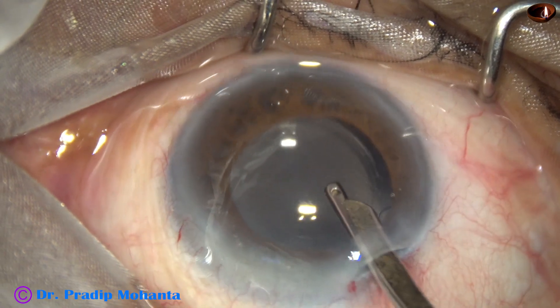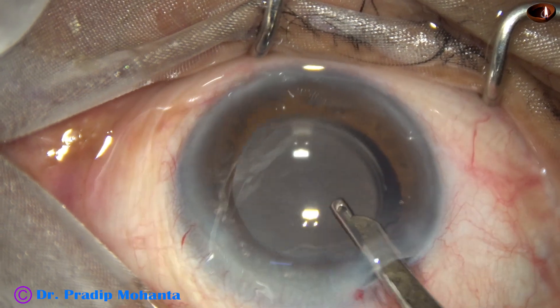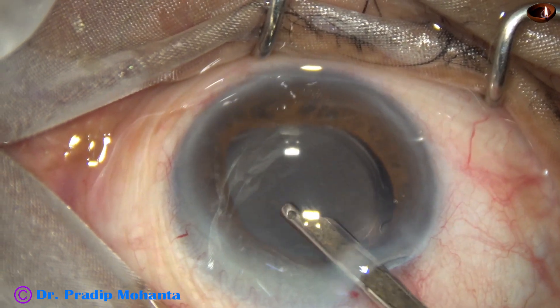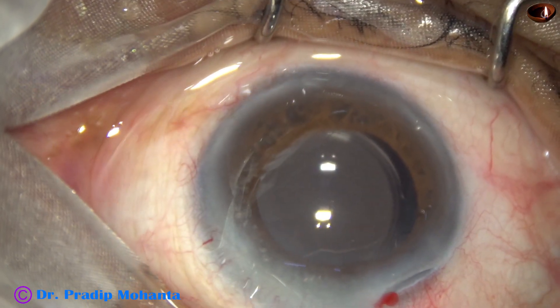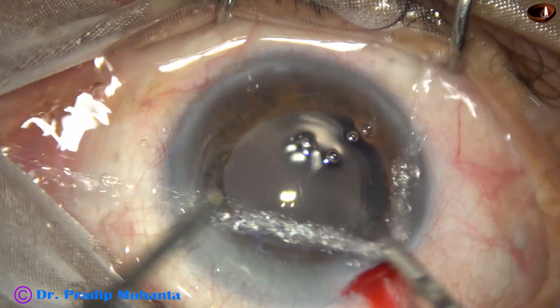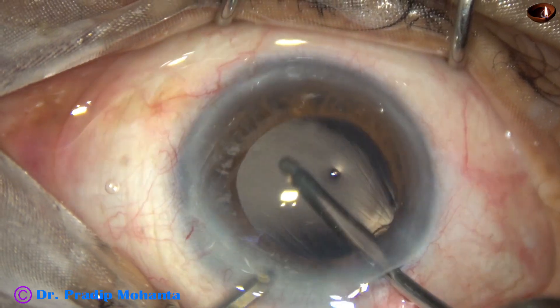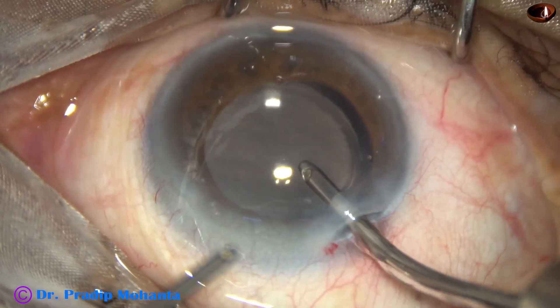I use the Simcoe cannula for irrigation and aspiration for some time, then come out and use the irrigation-aspiration cannula. The aspirating cannula was not used in this particular case.